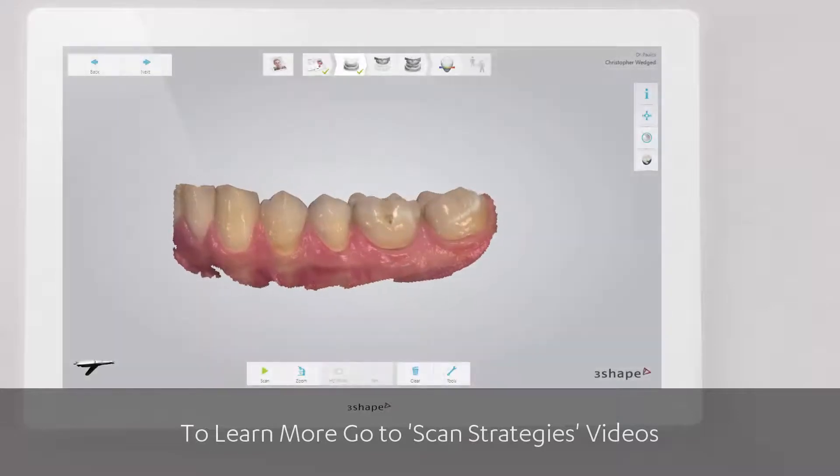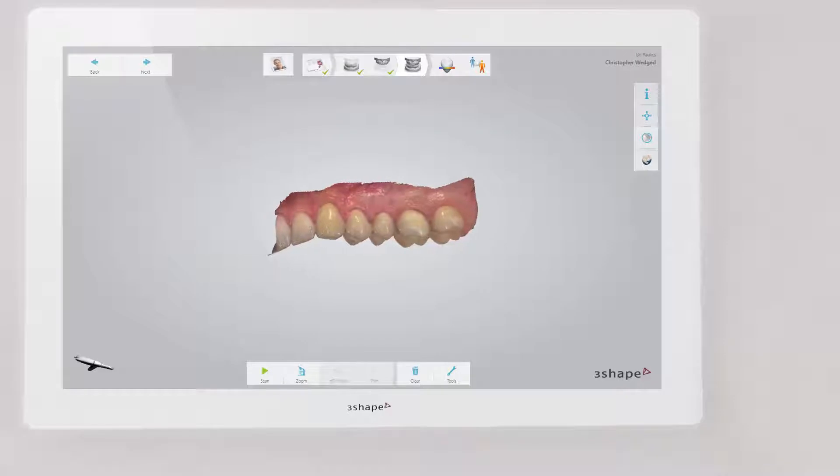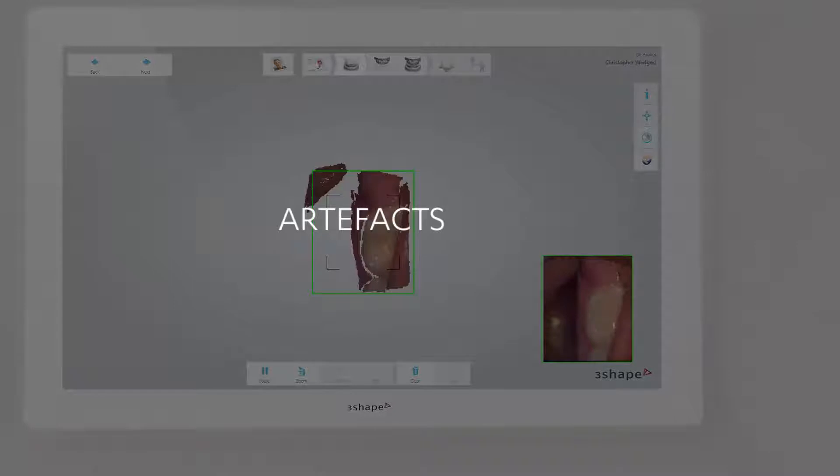Following the scan strategies ensures that a scan has high quality and precision. Furthermore, to obtain the best results, always avoid artefacts on the molar surface.